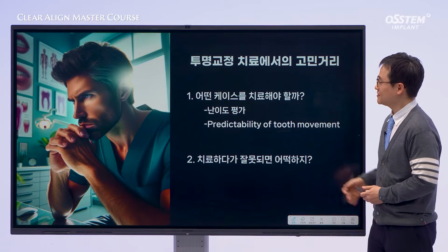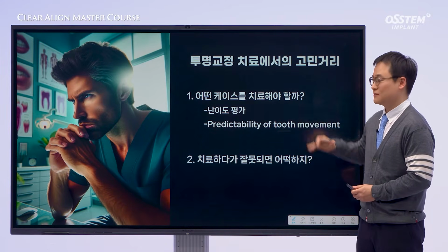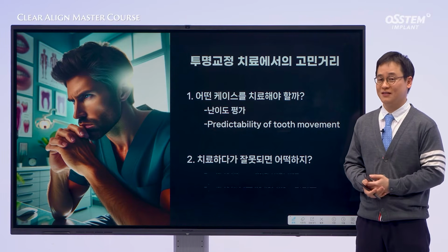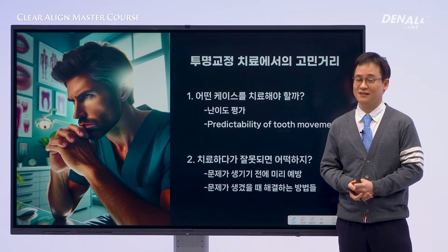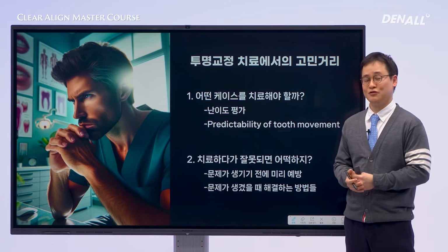If you're unsure about selecting appropriate cases for clear aligner treatment, it's important to develop the ability to assess case difficulty accurately. Just as a good batter learns to distinguish between balls and strikes, enhancing your judgment will allow you to identify cases that match your clinical skills.